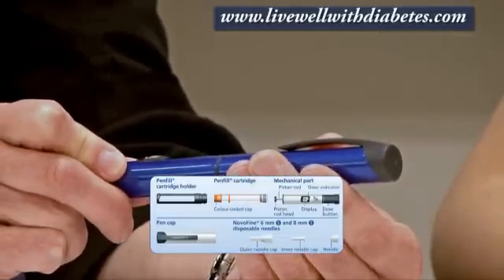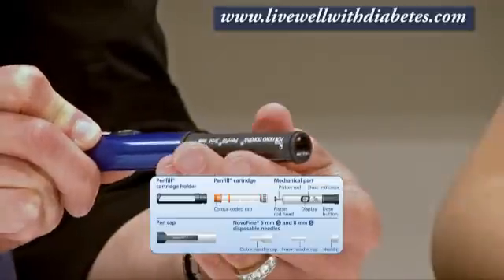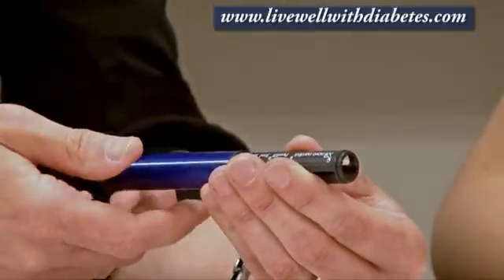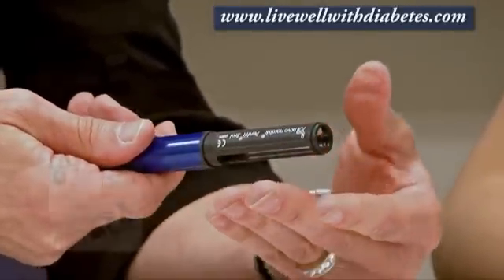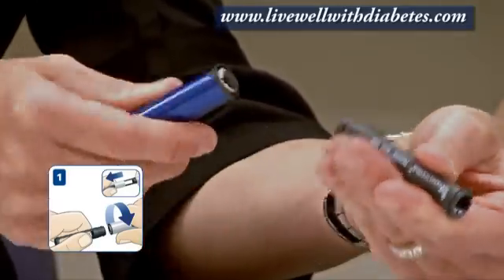To put a tube of insulin in, you would pull the cap of the pen off, and then these two pieces come apart in the middle. To do that, you put one hand on this side, one hand on this side, twist your hands in opposite directions and it comes apart.